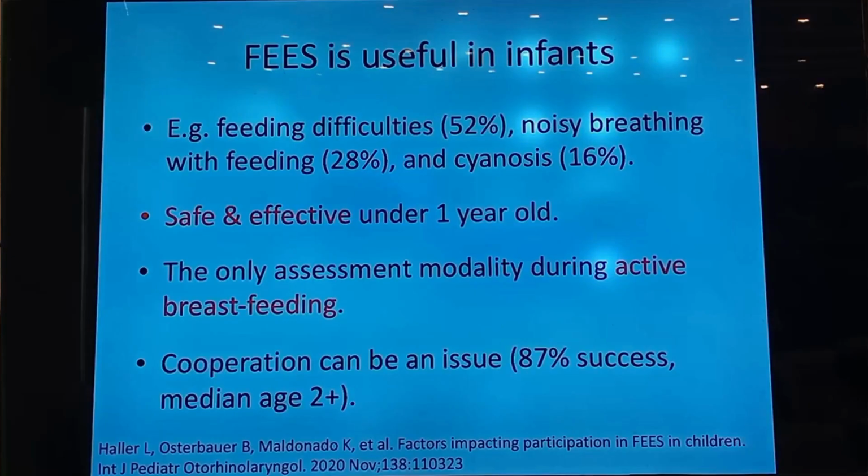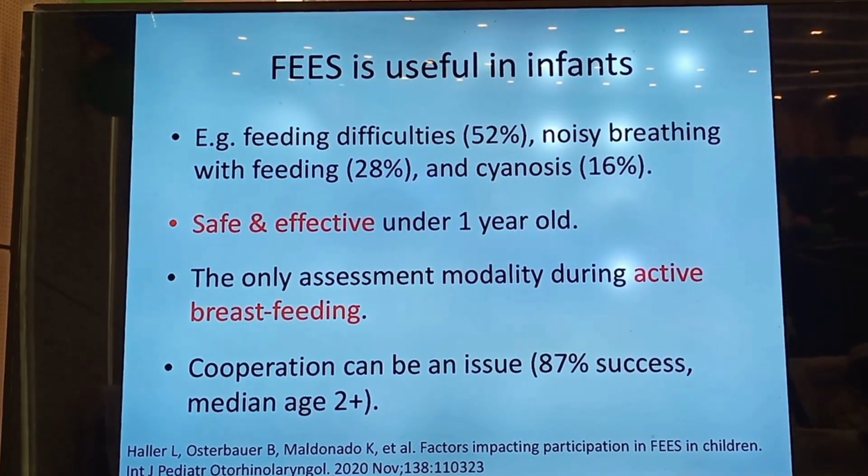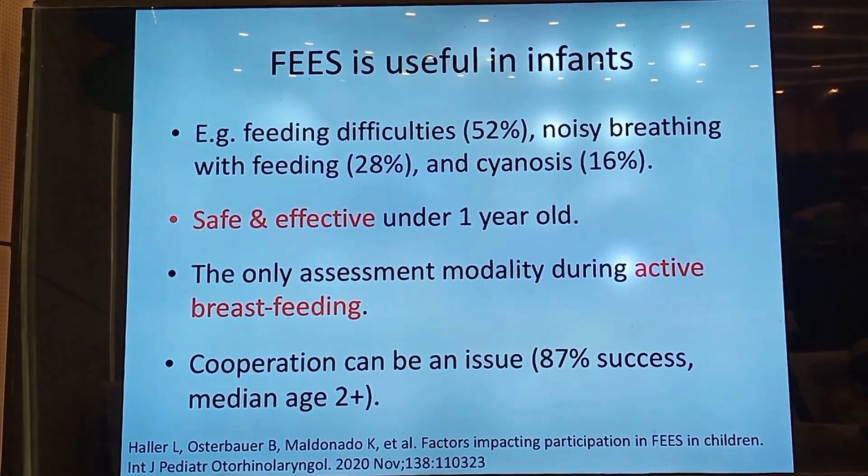It is the only modality that can be used during active breastfeeding. Cooperation of young children during feeds can be an issue, but there is one study that has examined this and has found high success rates in young children for median age of 2 years.